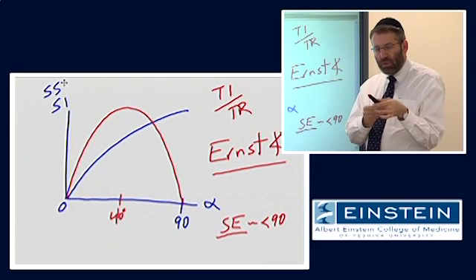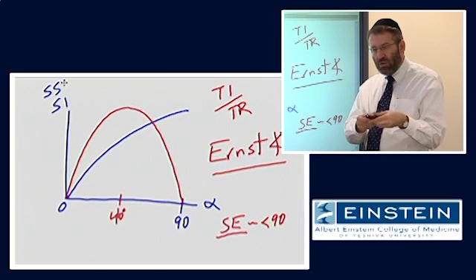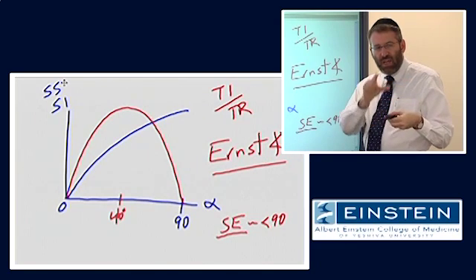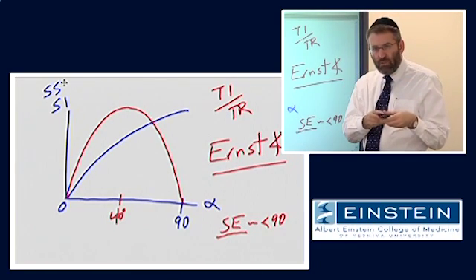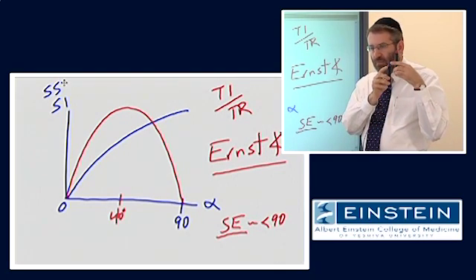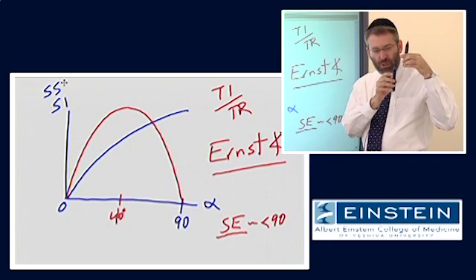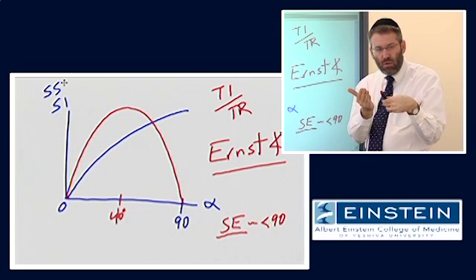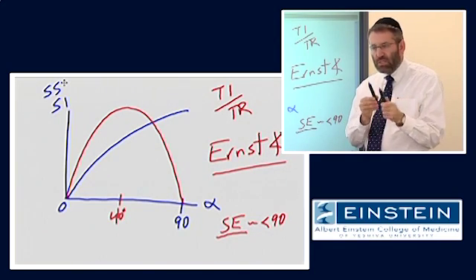Not only that, but on our next iteration, during our next TR, as these recover, they are much closer together and have a lot less distance left to recover. So when we watch what happens during TR, there isn't going to be as much separation of the longitudinal magnetization of these spins. In a sense, by using this narrower flip angle, we are suppressing the differences that show up in the signal related to the fact that the two tissues have different T1.